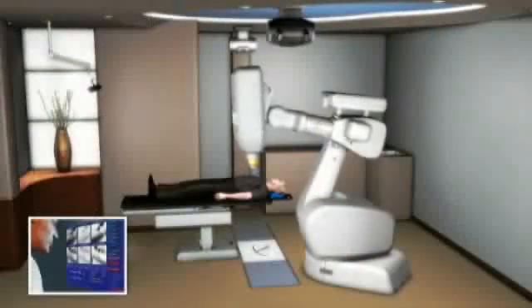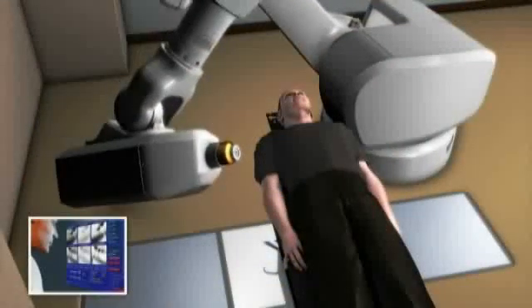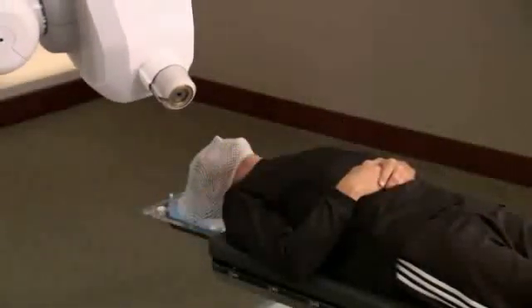The CyberKnife system's computer-controlled robot will slowly move around your body to various locations, from which it will deliver radiation to your tumor. You can expect each treatment session to last 30 to 90 minutes, depending on your specific tumor. Nothing will be required of you during the treatment, except to relax and lie as still as possible.